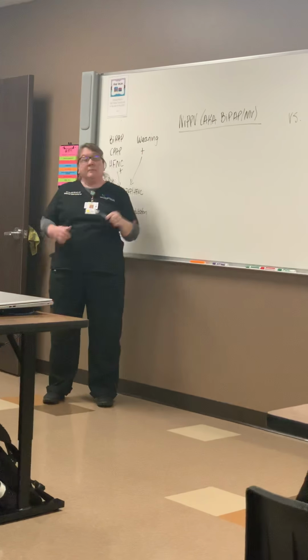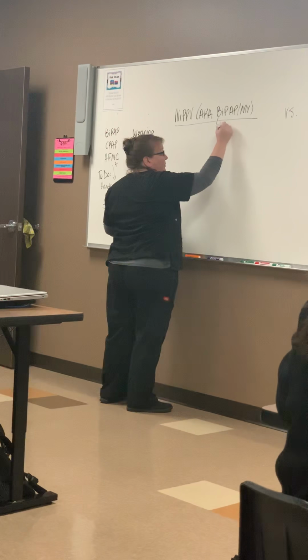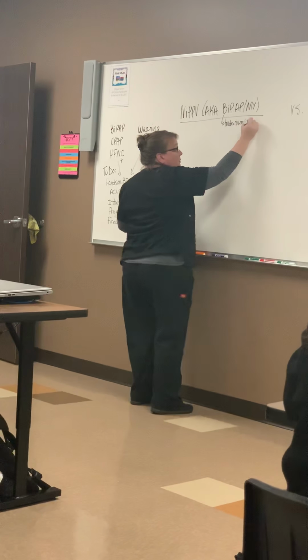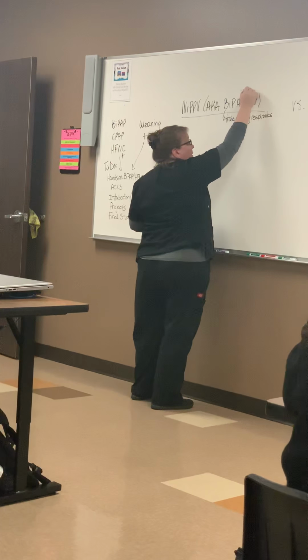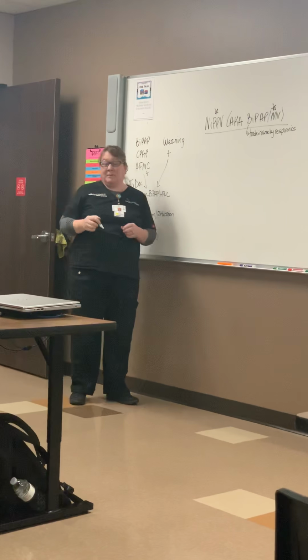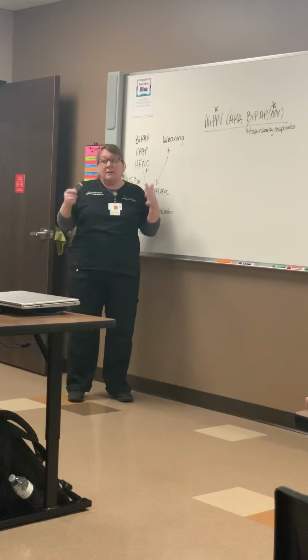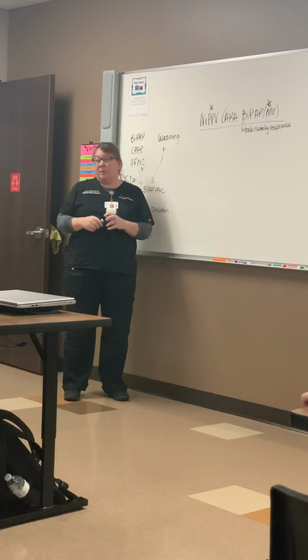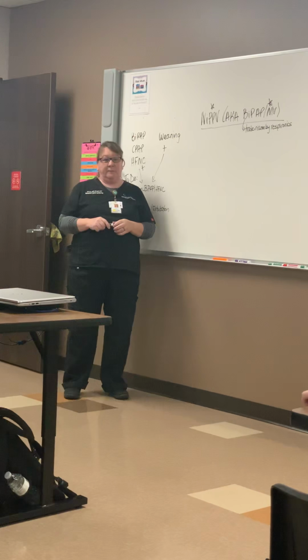BiPAP is a trade name, so it's actually trademarked by Respironics. So you're going to hear it here as NIV or NIPPV. BiPAP is a trademark name. Respironics is the first company to make one, which is why everybody calls it BiPAP, but technically only the Respironics machine is allowed to be called a BiPAP. So we're going to call it NIPPV or NIV.